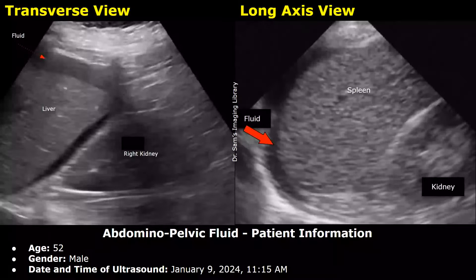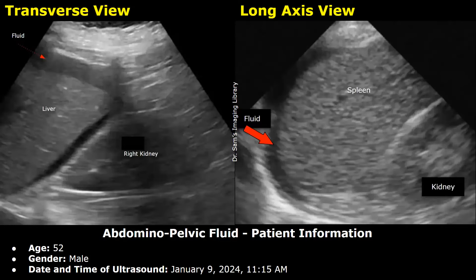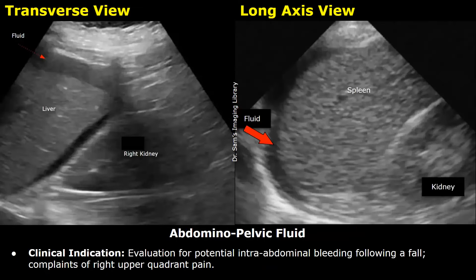Here is another case of abdominal/pelvic fluid. The patient is 52 years old, male. Date and time: January 9, 2024, 11:15 AM. Clinical indication: evaluation for potential intra-abdominal bleeding following a fall, with complaints of right upper quadrant pain.